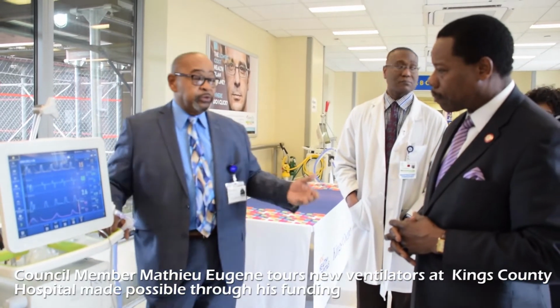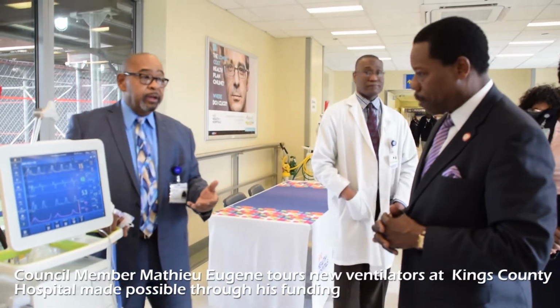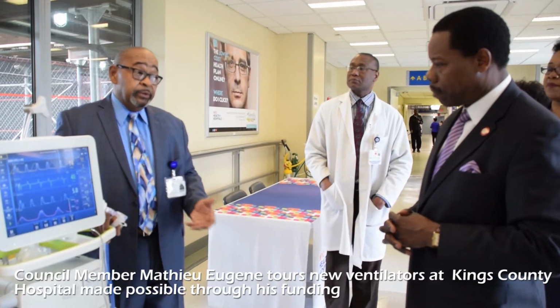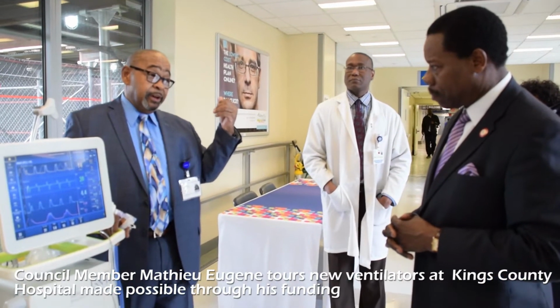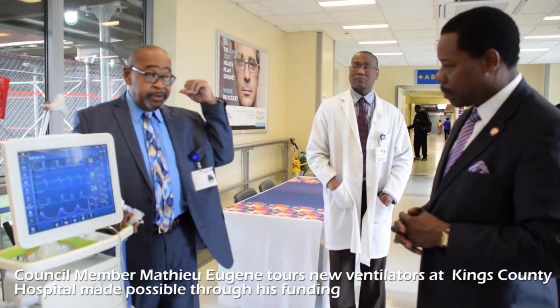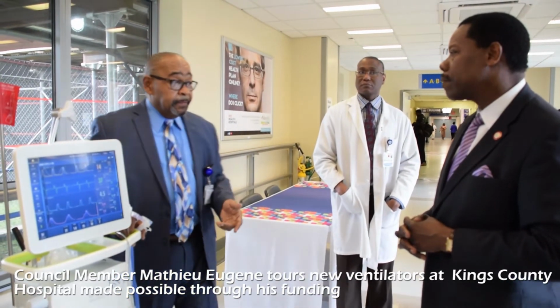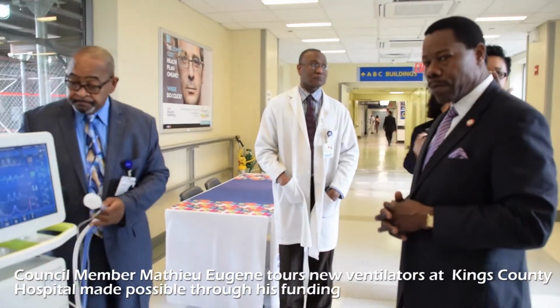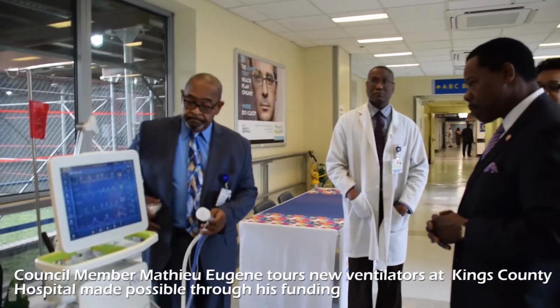So in essence, the answer to your question is yes, there is a way of communicating with another physician, maybe getting a consult from them. And they don't necessarily have to be in a hospital across the city. They could be in a hospital across the country. And the machines will also interface with our electronic medical record.